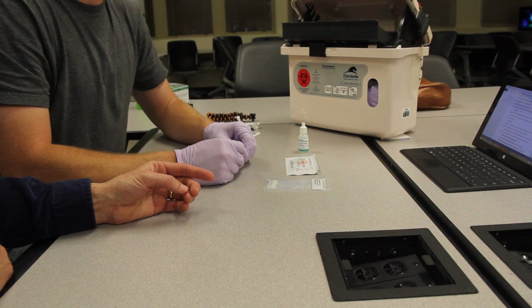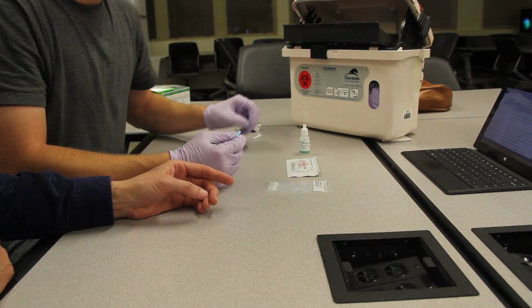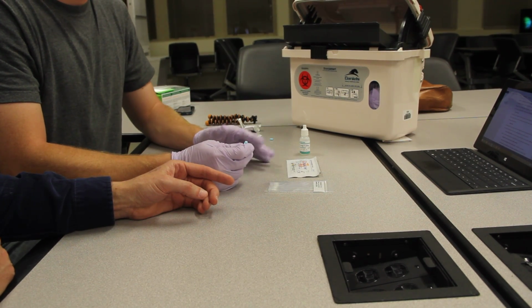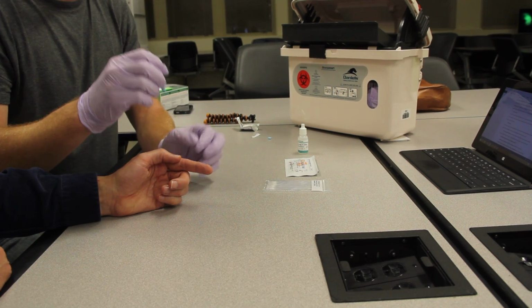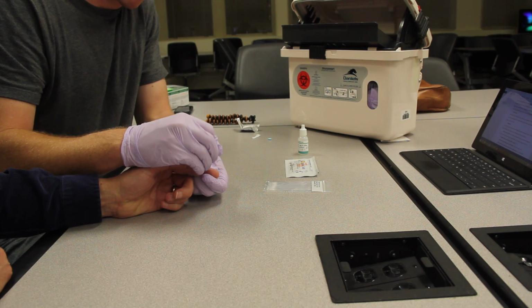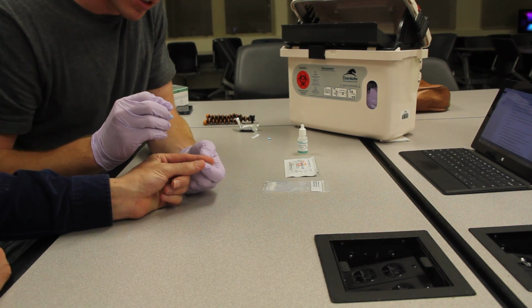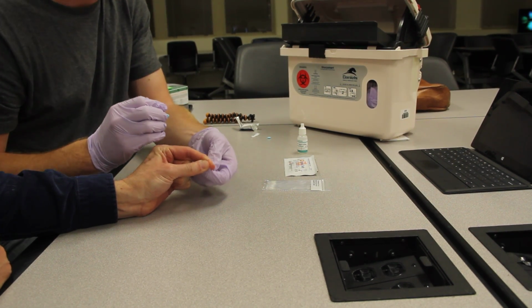Now the next step is to prick the side of the patient's finger. Here it's tempting to hold back but you really just have to go at it. You want to make sure that you can actually draw enough blood for the test to work. So I'm going to hold his finger steady, line it up, and go. And hopefully that'll produce a nice little drop of blood.